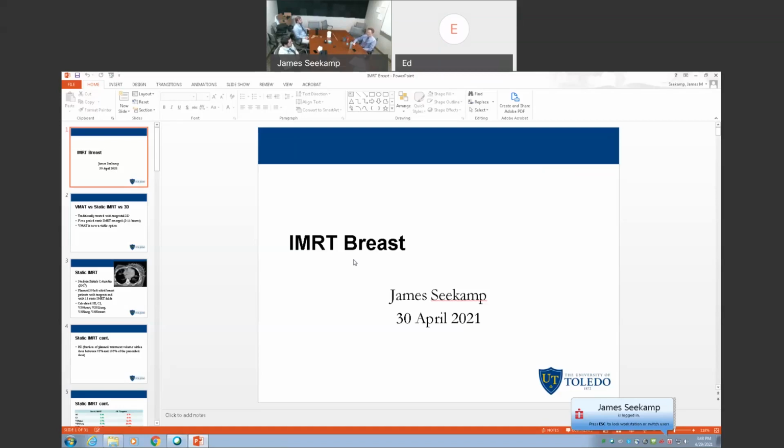But there are going to be times that kind of challenge that, because we had a patient, she had the breast expander that patients get when they have reconstructive surgery or prior to reconstructive surgery, and it stretches out the skin. That's what they're for.